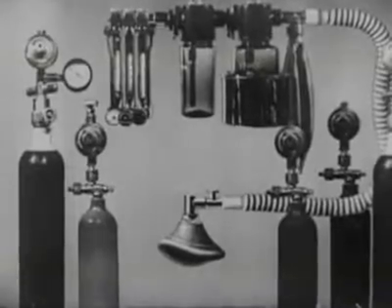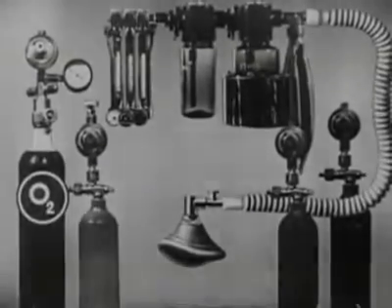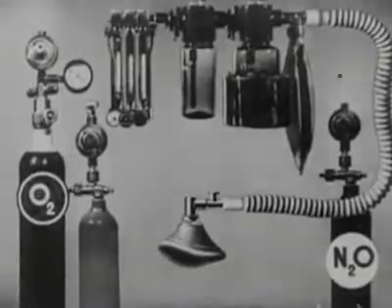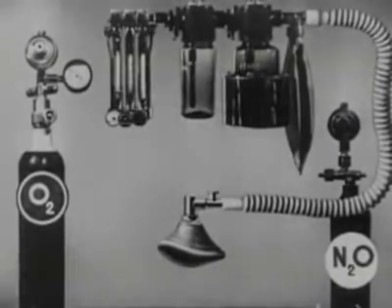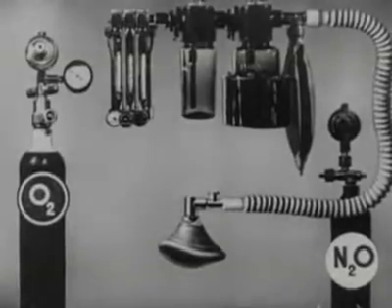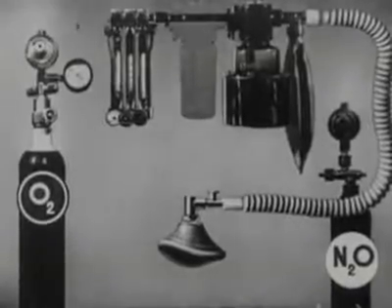For the sake of simplicity, we are removing the spare cylinders, leaving one cylinder of oxygen and one of nitrous oxide. The carbon dioxide cylinder can also be disregarded, and so can the chloroform bottle, which is often provided. Nitrous oxide is represented here by a white dot.